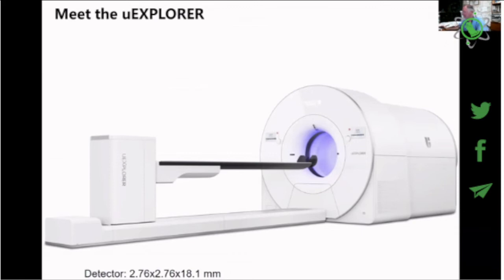At the large extreme, we have United Imaging with the machine which is called the Explorer. This is a 2-meter machine rather than a 15 or 20 or 30 centimeter type machine. This covers the whole patient. It has a sensitivity of 171. You remember we were talking about 20 or 25 or 30 or something of that nature.